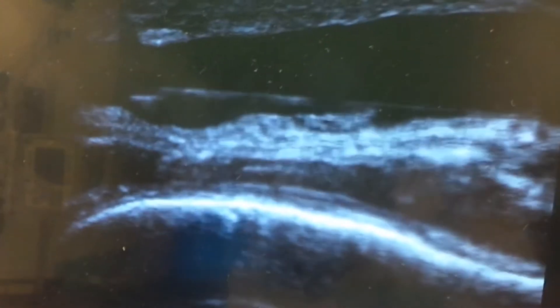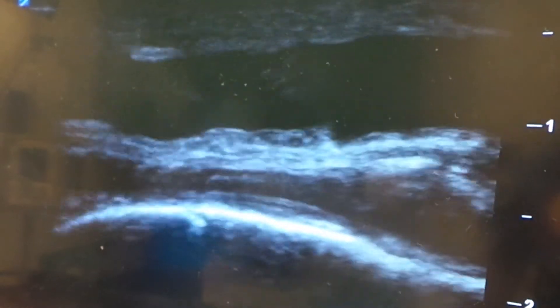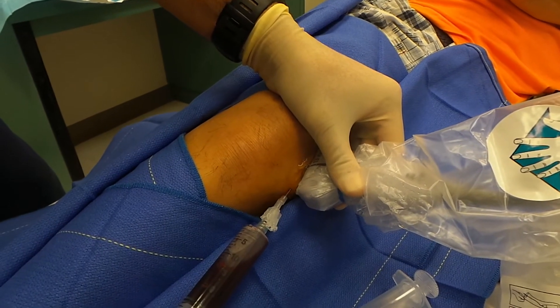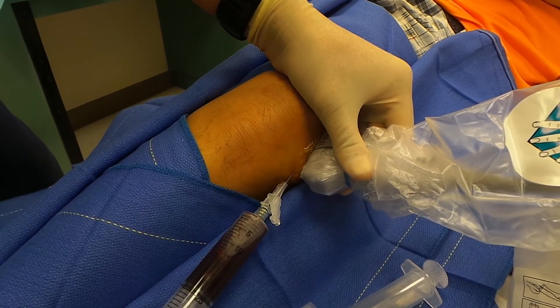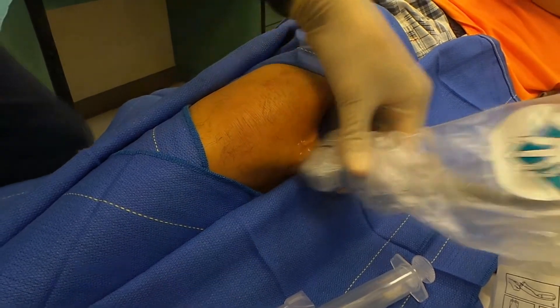You're getting the fluid out — you can see the space decreasing significantly. I think we're pretty good. Look at that. You can come out now. Did that hurt very much when the needle went in? It wasn't hurting much. Yeah, that freezes pretty well.